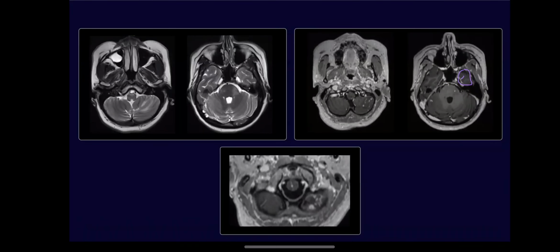And what's really important is that we go back and try to look at what could have helped us. So we have really bright residents at NIMHANS, and we went back and looked at the imaging again when we figured that, okay, this is actually a granulomatous infection. And one of our very bright residents really picked on this and said, ma'am, come back and look here. This is actually a ring enhancing granuloma. Now, what initially we thought were just dot-like enhancement and inflammatory actually turned out to be granulomatous.